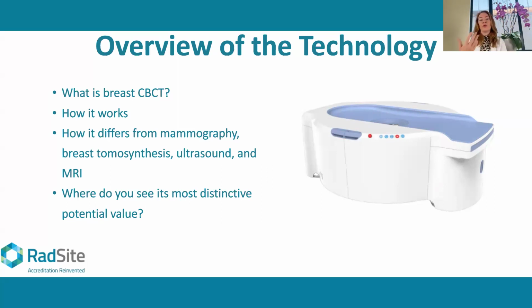And one of the great advantages of this technology over an MRI, which has that 3D, is it's much, much faster. And because it is using X-rays like a mammogram, it has the ability to see some calcium deposit patterns, which the MRI can't see. Mm. Very, very interesting. Thank you.